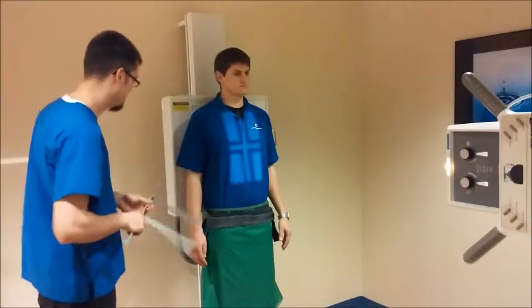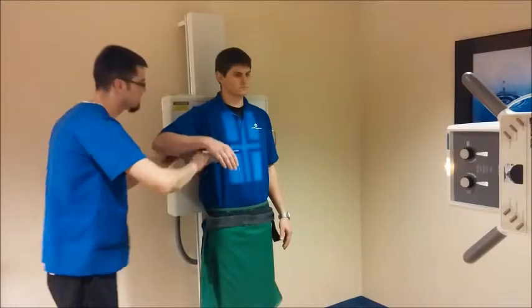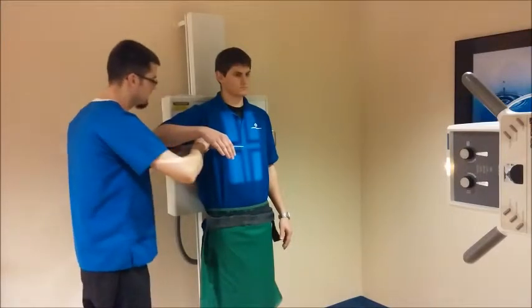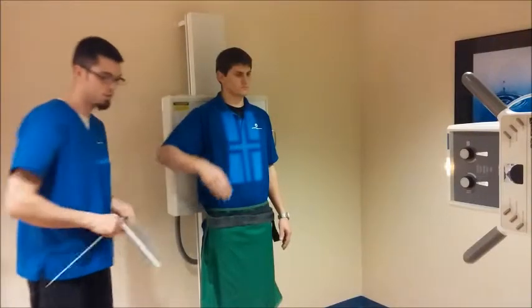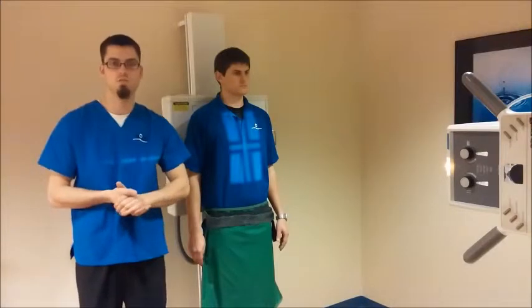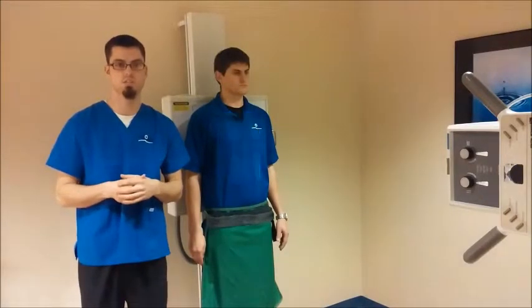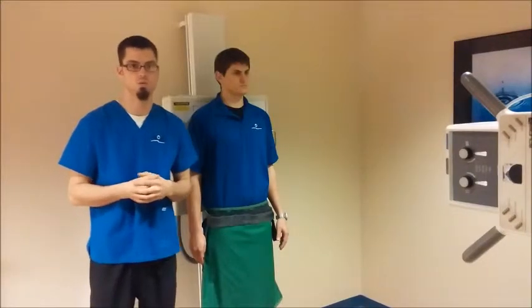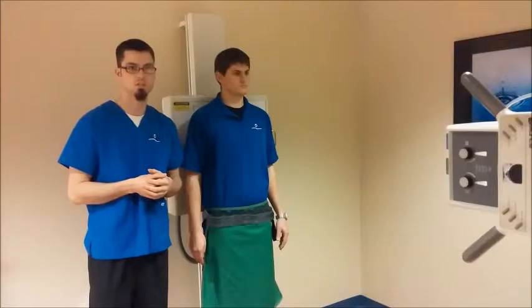We'll also want to measure here, so I'm going to have you step your arm. You want to measure right through where the central ray enters the patient. Measures about 24. For this exam, you will want to use a small focal spot for bony detail and also center chamber of the AEC, and you will want to take this projection on suspended expiration.